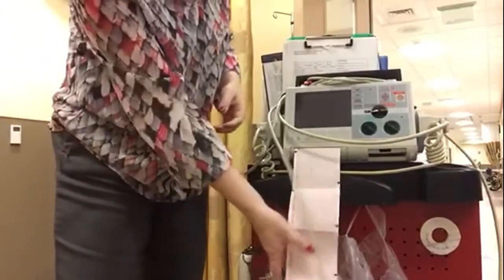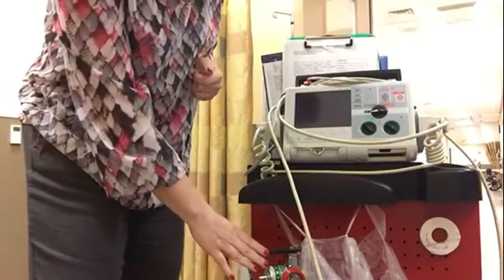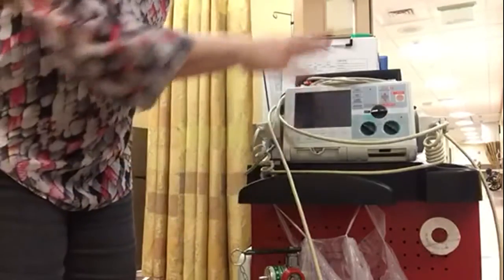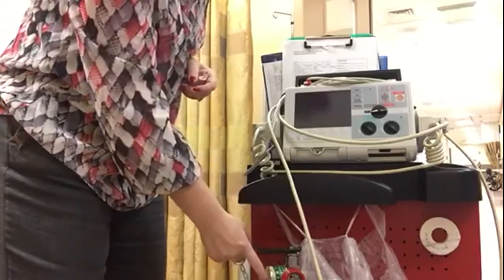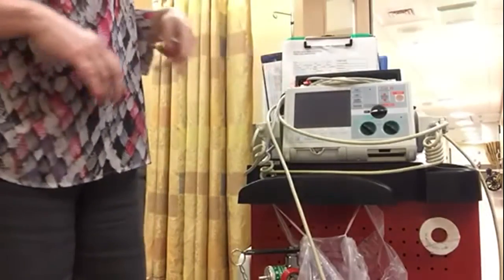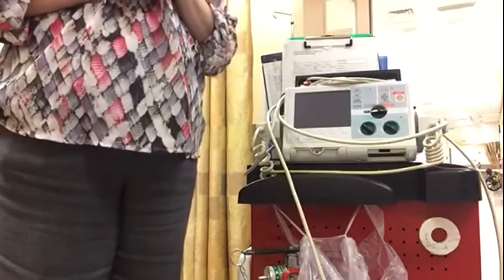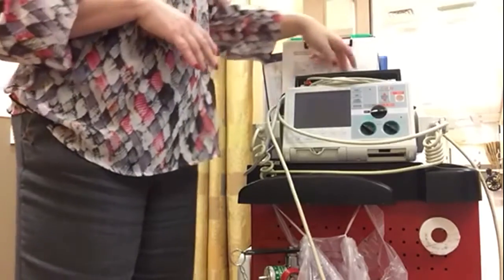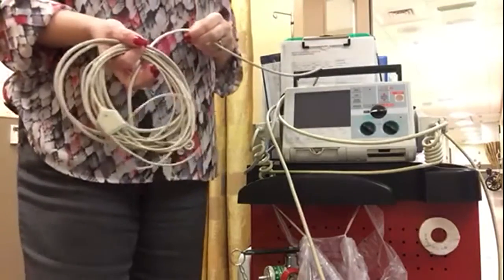On the other side, there's an oxygen tank. When checking the crash cart, you must make sure there is enough oxygen and that it turns on. There are also extra Ambu bags in a couple of different sizes, and our defibrillator. This is a Zoll defibrillator — an external defibrillator that also has cardiac monitor capability.